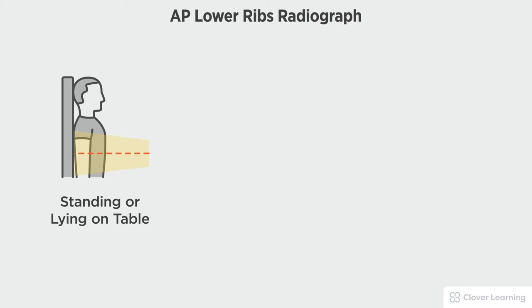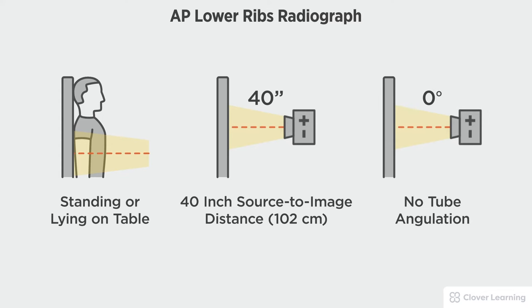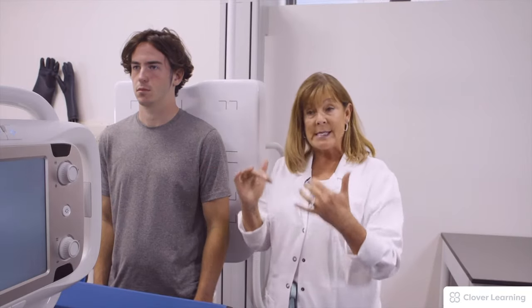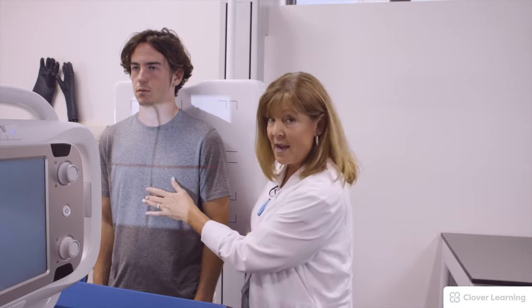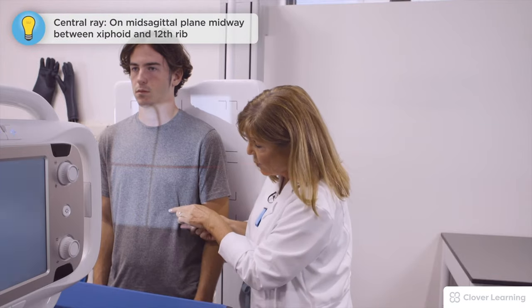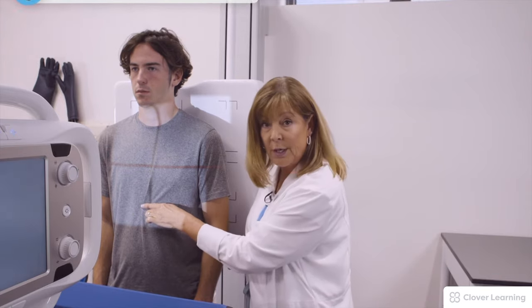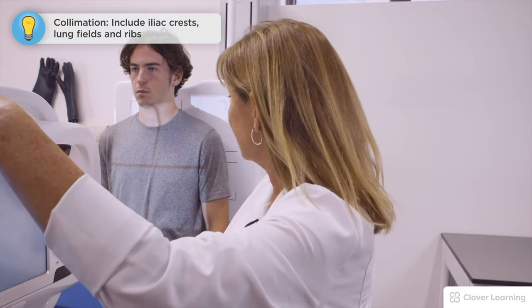In this view we will be demonstrating the AP lower ribs. The AP lower ribs should be performed with the patient standing at the upright bucky or lying on a table with a 40-inch source to image distance and no tube angulation. For AP below the diaphragm, the central ray is brought down to halfway between the xiphoid and the lower rib, using the mid-sagittal plane.